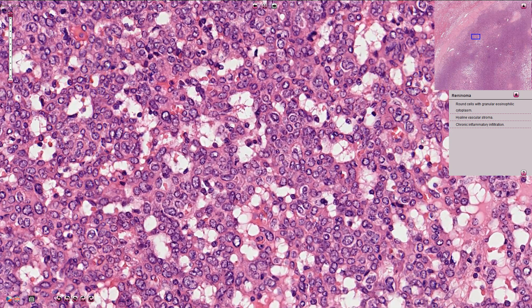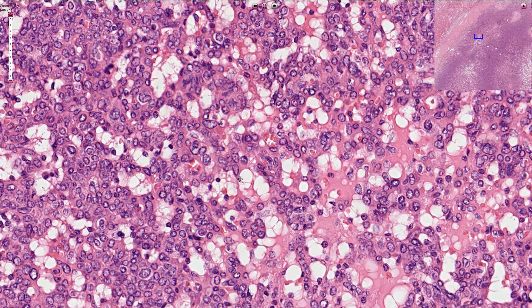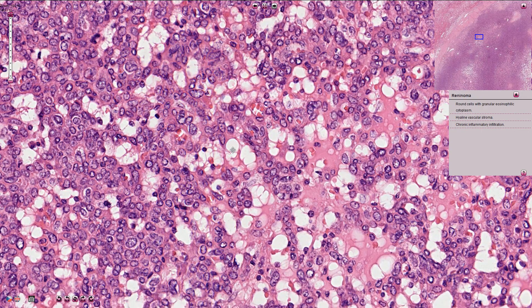The stroma in between the cells is typically very vascular, and here we see multiple small capillaries. In some areas we can find stromal hyalinization, as here for example. Quite typical is also chronic inflammatory infiltration composed of lymphocytes.